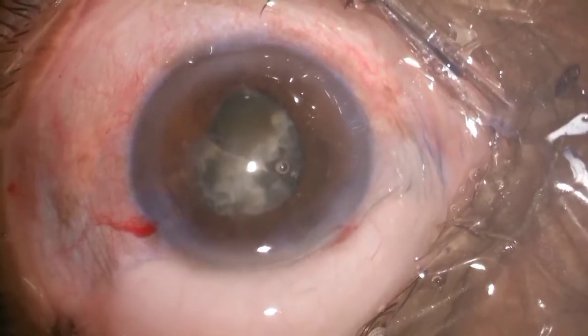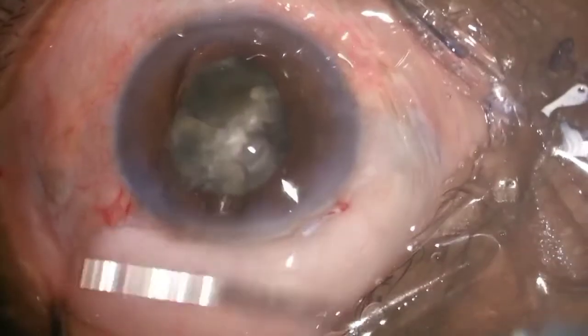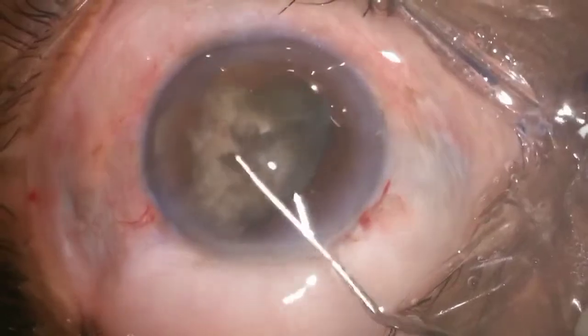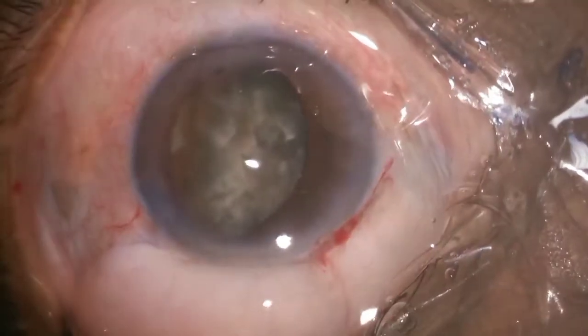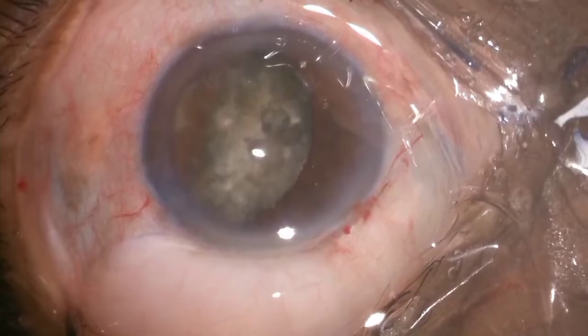I should have raised it, but I decided to continue with it. So after putting visco, I inserted the dialer, and I put one half of the nucleus in the AC, the other half in the bag, and I decided to go for phaco chop then.